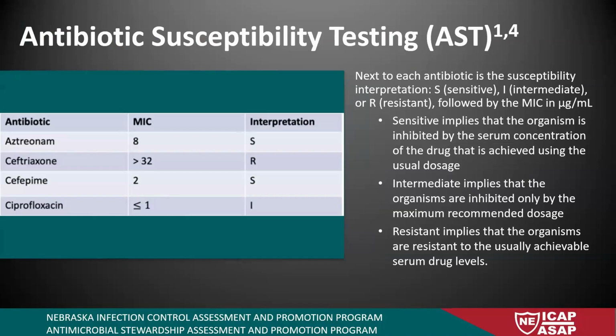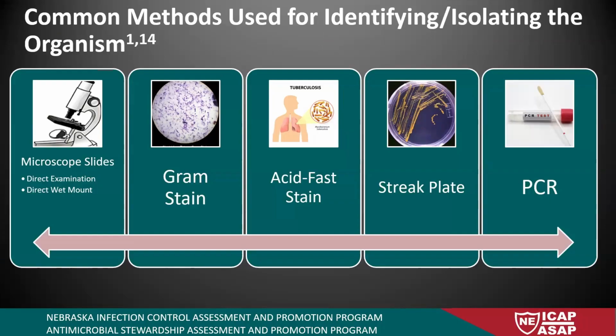Here's an example of what a blood culture result looks like. I always think that there are several different ways you might see this. So again, it says culture result. This was the gram stain. They do the gram stain first. We talked about that being a method that they use in the lab. And then they formalize the report later, but it can take a long time to get to that susceptibility report.